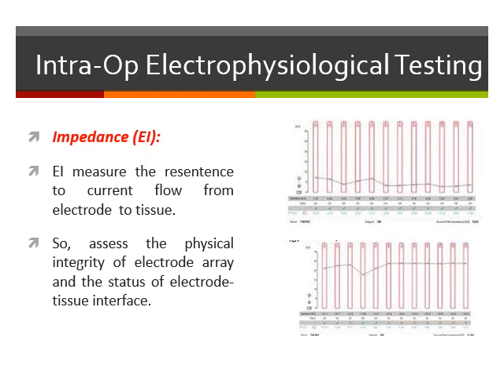we will have what we call an open circuit. This means that there is no current flow from the electrode to the surrounding tissue. There is a space around the electrode. There is air around the electrode. Also, if two electrodes are in contact with each other, they will give us what we call a short circuit. Okay, so we have an open circuit if the electrode is not in contact with the tissue at all, around air or outside the cochlea. Short circuit is in the case of tip fold-over or when two electrodes are in contact with each other.